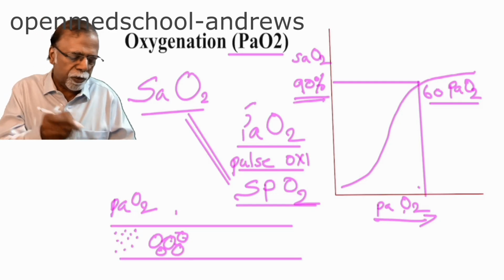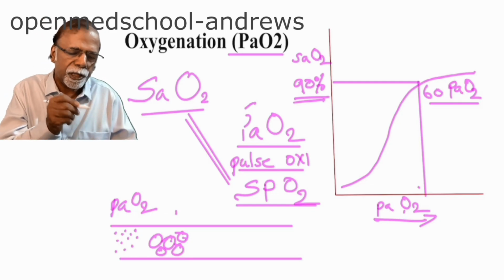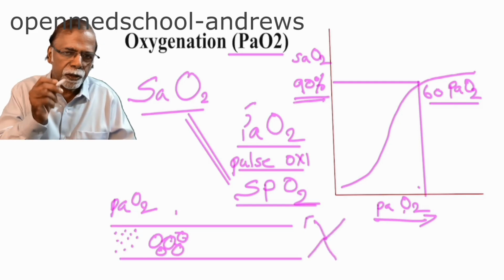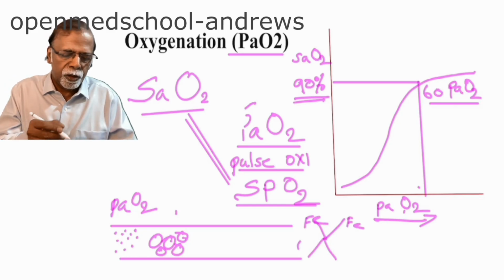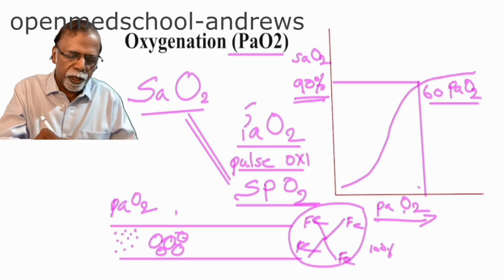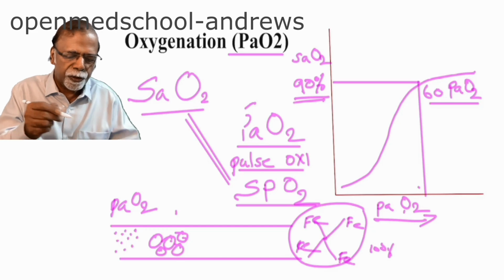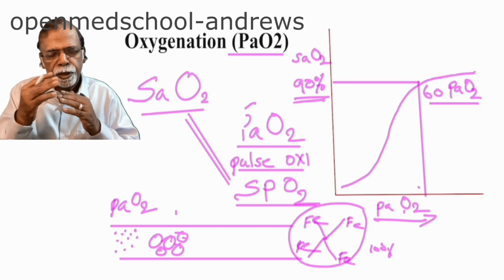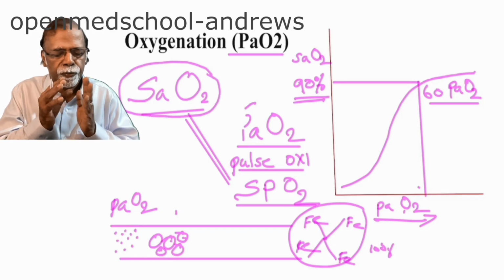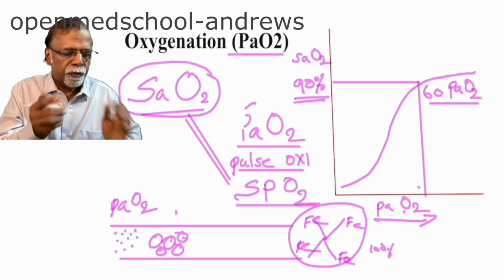So what is SpO₂? SpO₂ is measured, as already mentioned, by the pulse oximeter. It is the percentage saturation of the hemoglobin with oxygen. We know that hemoglobin contains 4 iron molecules. If all are saturated, you can say 100% saturation. So in the RBCs, depending upon the oxygen saturation of the RBC hemoglobin, that is the SpO₂.